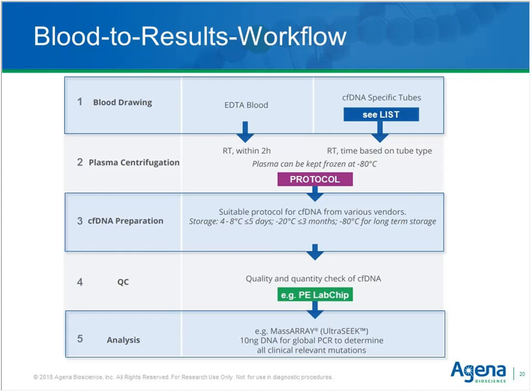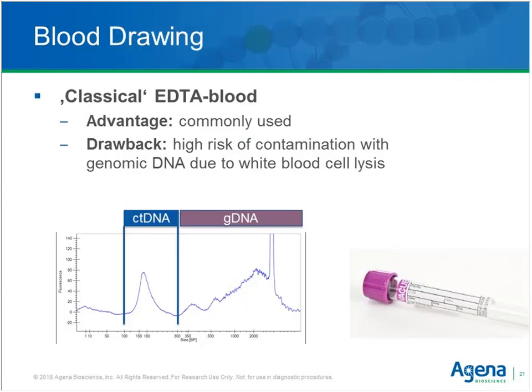At that stage, before entering any precious, low-abundant DNA material into the liquid biopsy analysis, in step 4 it makes a lot of sense to perform a QC step to make sure that you don't have any contamination and that you have the desired material in the required amount. And then in step 5, it really comes to the actual analysis of the precious sample. We'll talk about all of these steps in a little detail.